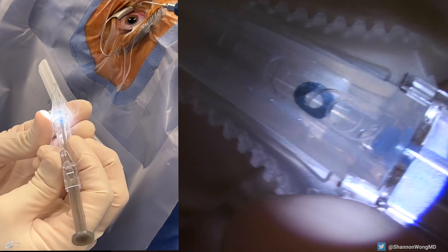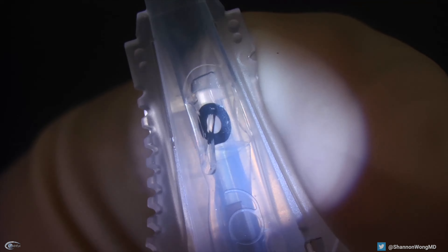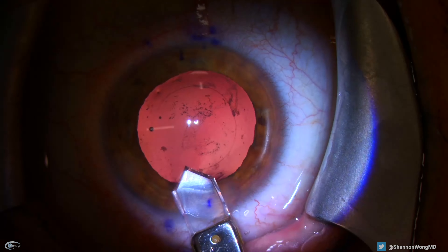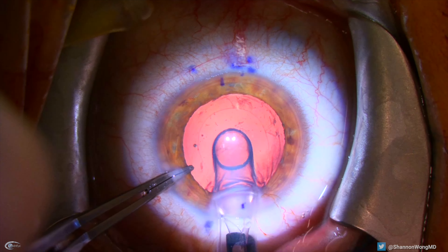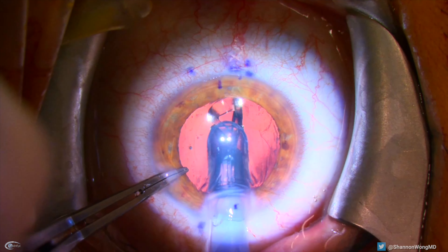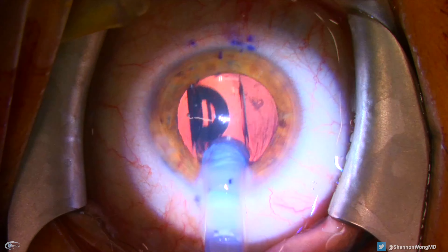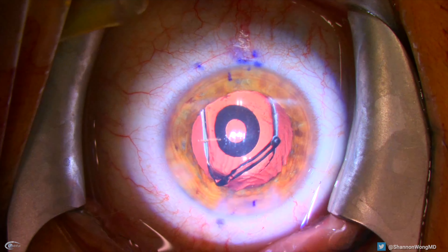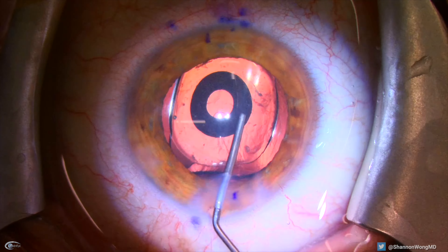Our usual primary incision diameter is 2.8 millimeters. The Bausch and Lomb cartridge requires a 3.2 millimeter incision, which we create by widening our 2.8 millimeter incision with our diamond keratome. The lens implant is slowly advanced into the eye. There is a silicone plunger that pushes the IC8 down the cartridge and into the eye. The silicone tip is under compression inside the cartridge and then expands slightly once inside the eye. My sense is that this lens can be inserted using the same injector system we use for our panoptics lenses using a 2.8 millimeter incision.